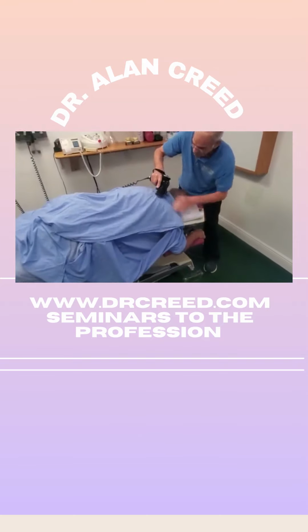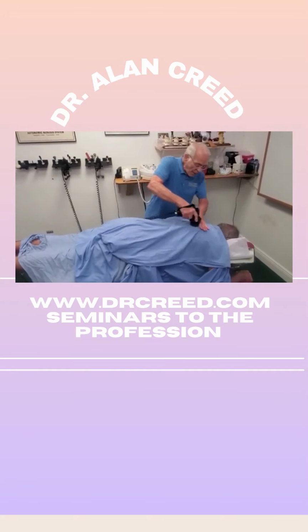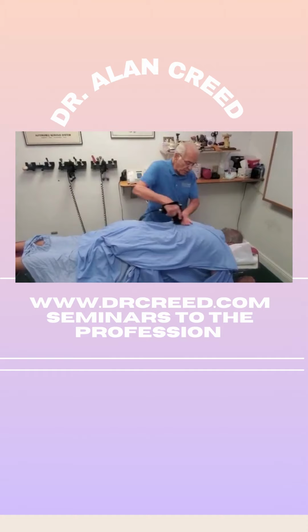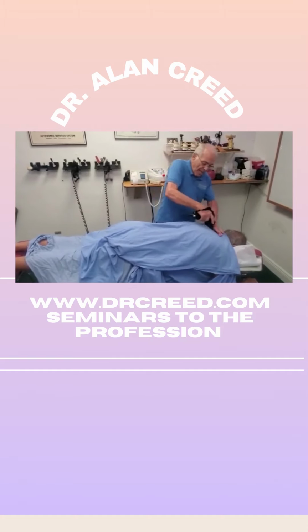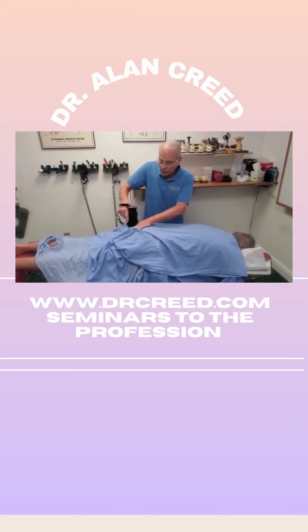Okay? So I'm showing you how you can actually stimulate. Now I've got a higher situation here. I'm now waking up the muscles. Before I was flushing them. Now I'm waking up the muscles and getting the fire better. So the person will stand up and stand up straighter and feel better.